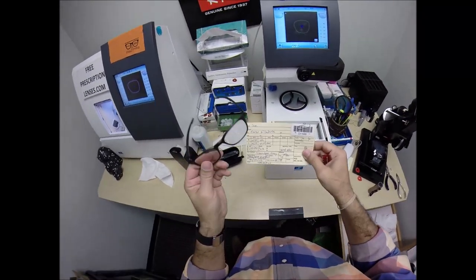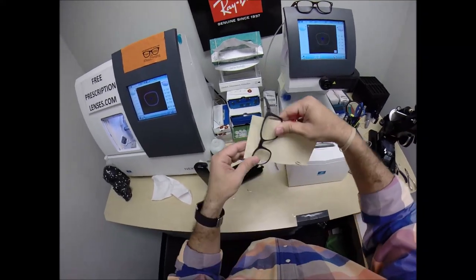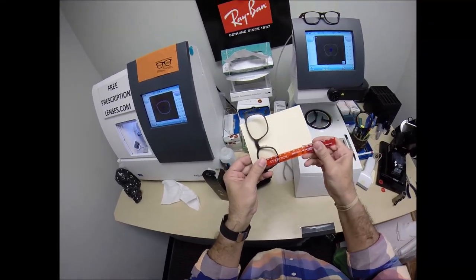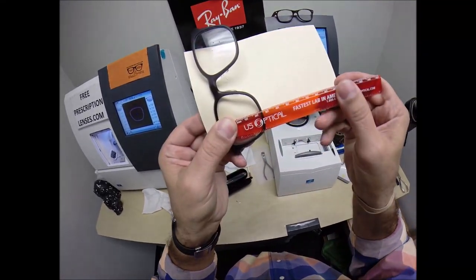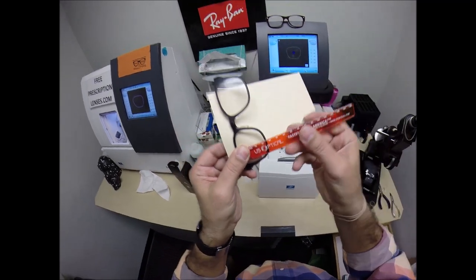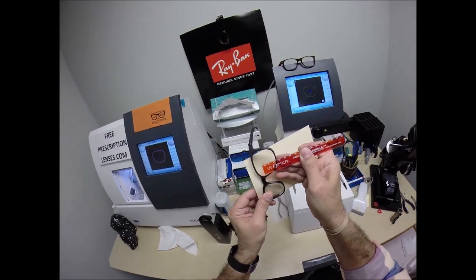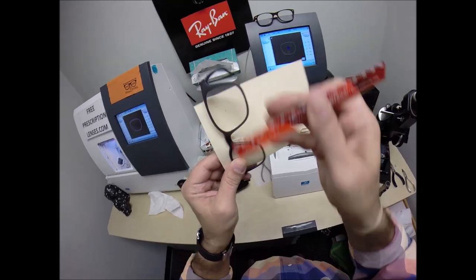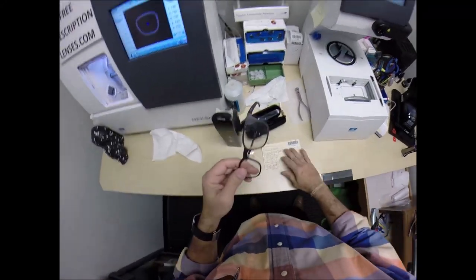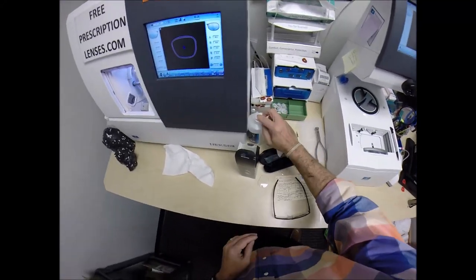Your optical center height is 23. That's what's going to sit directly in front of your pupil where the invisible bifocal begins. When you look at the center of the frame, we're getting 23 millimeters. We're going to do the same thing here. 23. Man, the kit is good. You know, I couldn't have done a better job if I had cut these lenses myself.